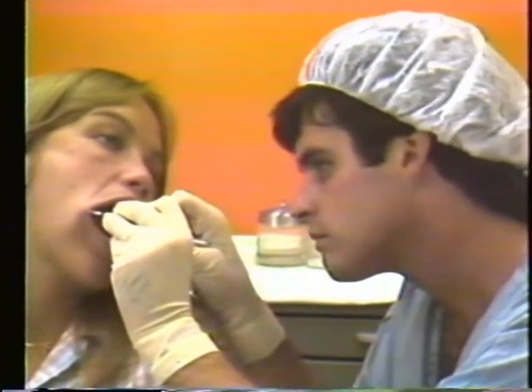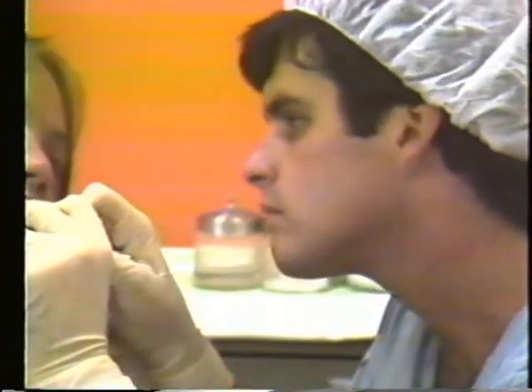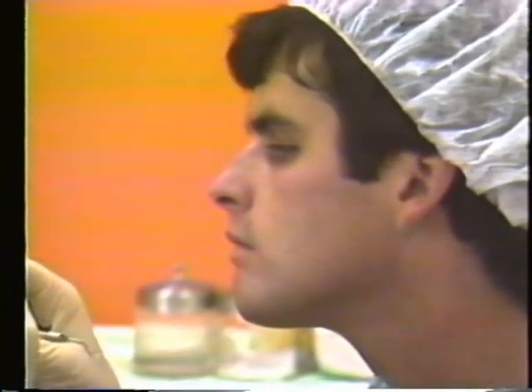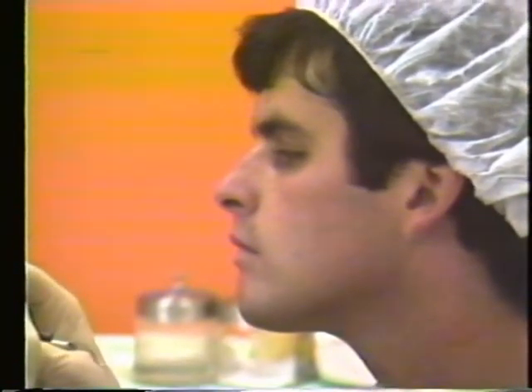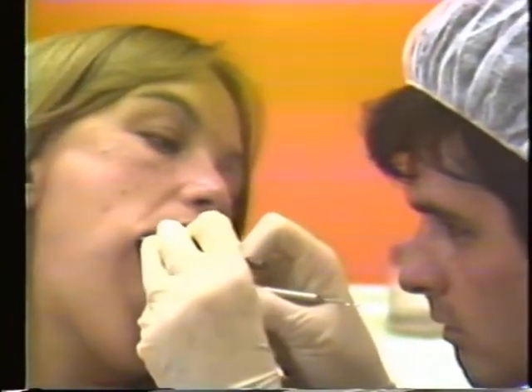The technique you are using is aseptic, not sterile. It will take you a while to become used to working under these conditions, but it will soon be just another skill you've mastered. During treatment of the patient, there are several unbreakable rules.